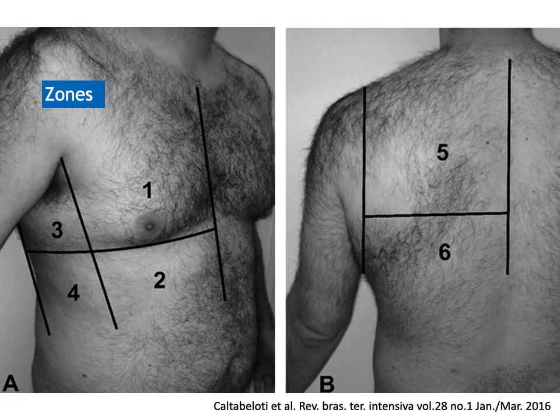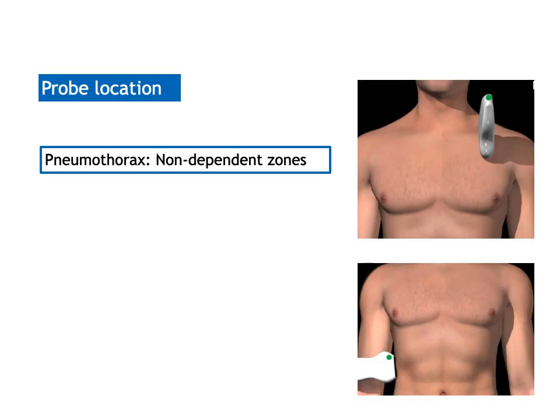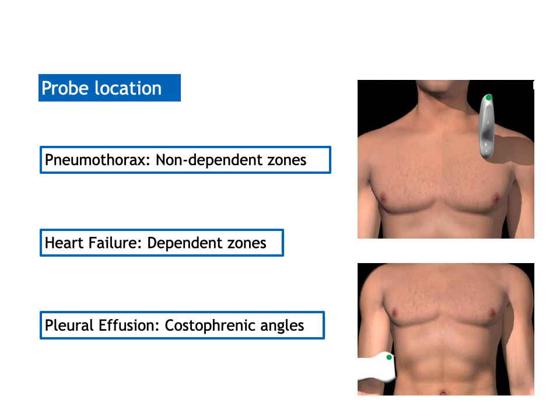It might be challenging and difficult to get very posterior in supine critically ill patients on the ventilator who are quite sedated and paralyzed, especially in the setting of respiratory failure. But I would always advise trying to get as posterior as we can, because this is where the devil hides, where you could often see the consolidation or the atelectasis.